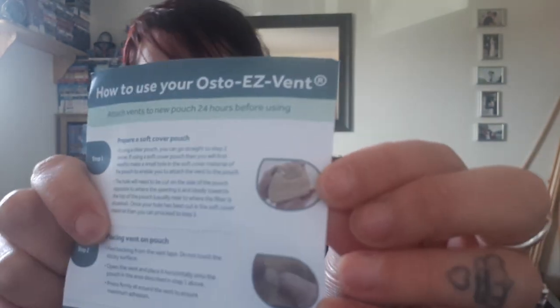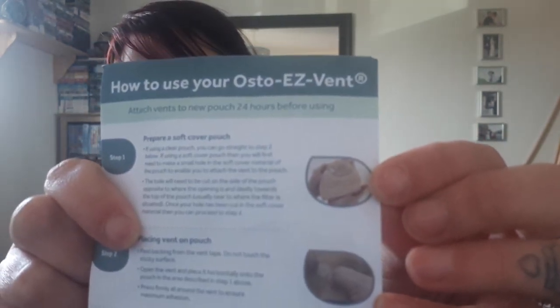The instructions say to attach to a new pouch 24 hours before using, but then at the very bottom it says once the hole is made, close the vent — the pouch is now ready for use. So is it ready now or in 24 hours? The instructions also seemed clearly designed for a two-piece bag, but two-piece bags don't have flaps. And if you have a two-piece, you don't really need a vent because you just pull apart the top and it'll vent.